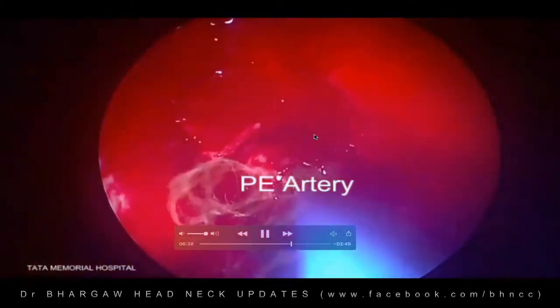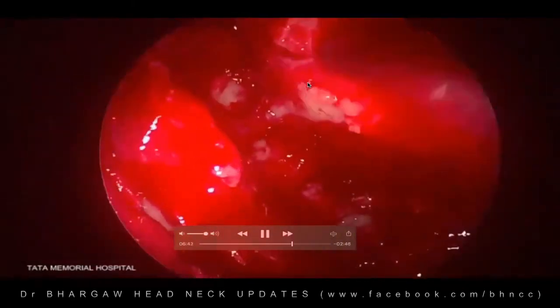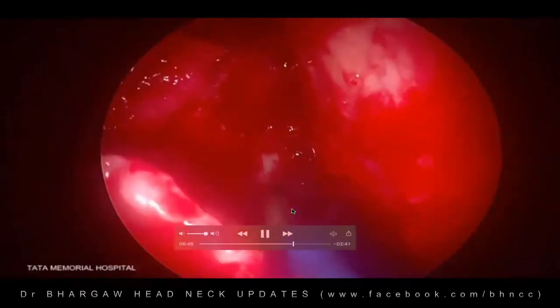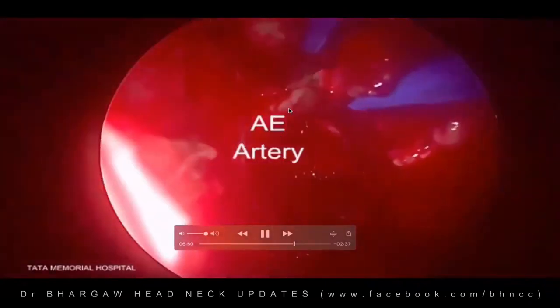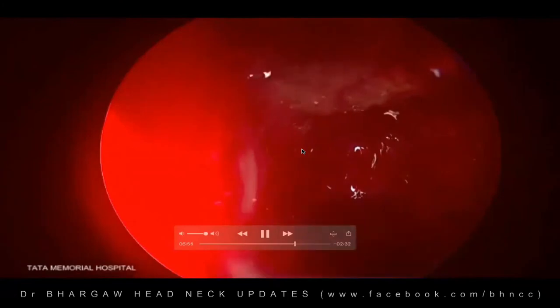That's the posterior ethmoidal artery. You need to cauterize that pretty well there. And we'll see the anterior ethmoidal artery also. There you see the anterior ethmoidal artery, which we are cauterizing again. That's the anterior ethmoidal artery. This is the anterior ethmoidal artery on the other side. You need to cauterize them on both sides before you go ahead with your procedure here.